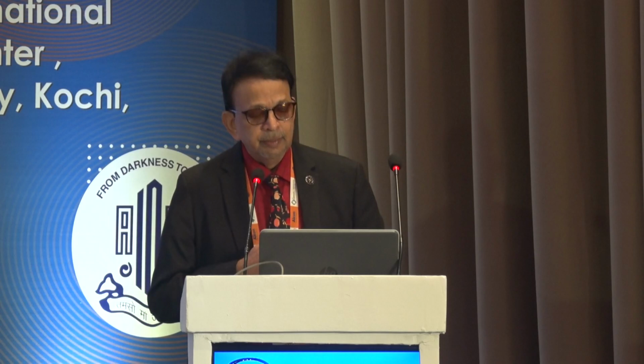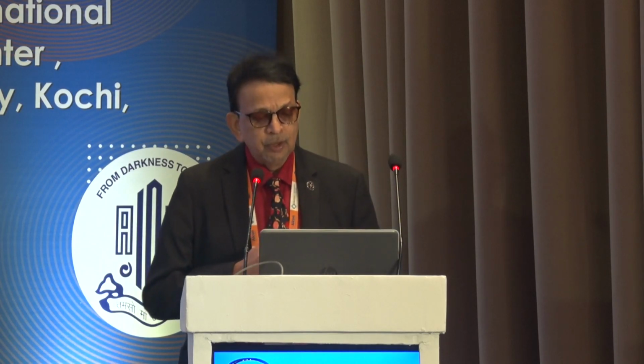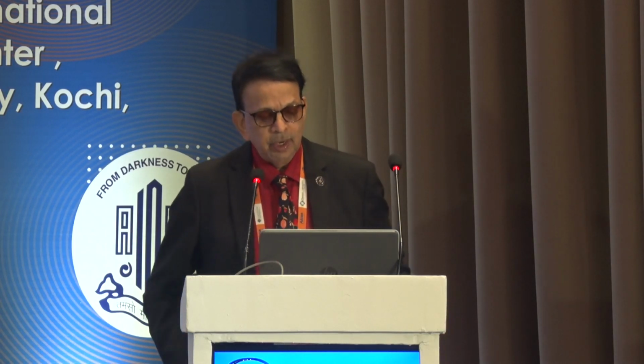You can see the pre-cuts are already there. The chopping is already there. I need to go in and separate that in the cleavage planes, which are already there, with the chopper. Sometimes I can use only a Sinskey hook, and that opens up the posterior nuclear plate because it is already cut, and you can even soften the nucleus also. So it makes life easy, not much phaco power, and the amount of phaco energy is very, very less in this case.